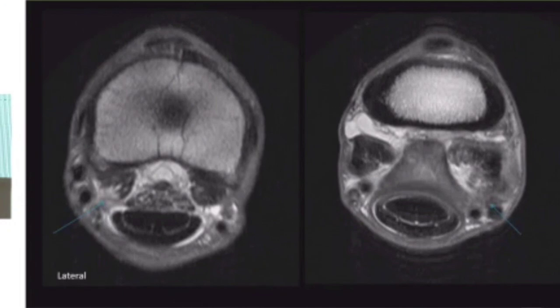And we can tell this medial suspensory branch, as we knew, is quite enlarged and has abnormal increased signal. So we were correct that there is an abnormal finding there. But what was not found on the original ultrasound is when we go down below the fetlock. So now this is P1, and we're looking at the oblique sesamoidean ligaments. Here's the straight right here.